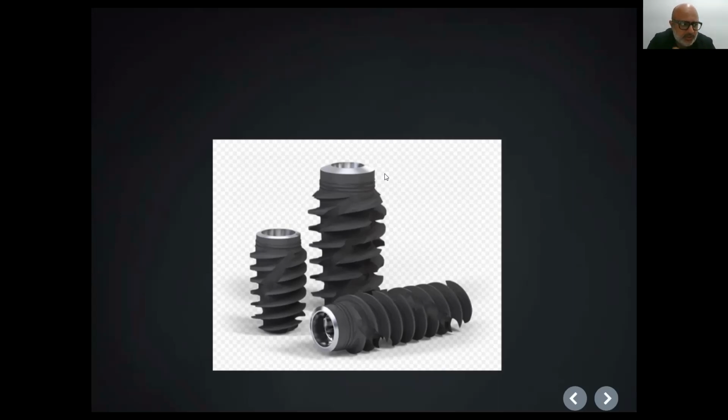As I've been teaching and students have been using it, I found that's the one that they seem to go, wow, I finally solved it. I haven't got a million ways of restoring it, and I don't have to choose from these complex menus. It's a simple but quite flexible system, which is important. Okay, the implant goes down the hole that you drilled. End of story. The BLX tends to be a bit like a stallion. You have to sort of keep it in its place. It's much better in experienced hands.